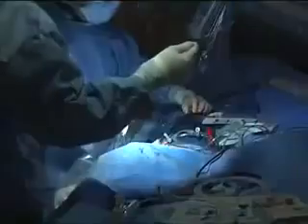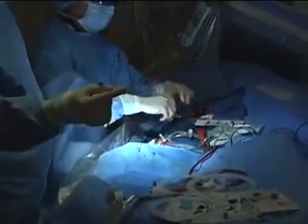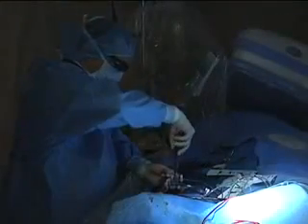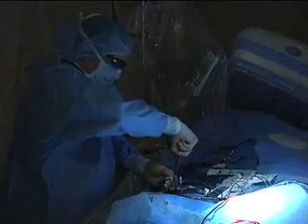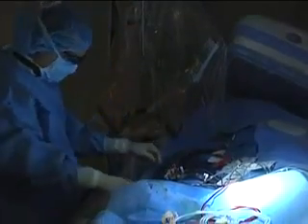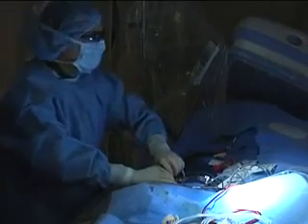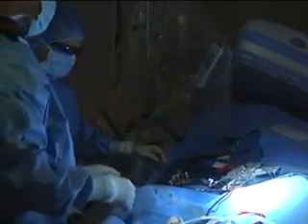Now the stent is in there, and you'll see the balloon inflate, and the balloon is inflating. We're now removing the balloon, which is deflated. We use nitroglycerin to treat the spasm that can occur inside the artery when you're working inside the artery. Sometimes that creates vasospasm in the vessel.